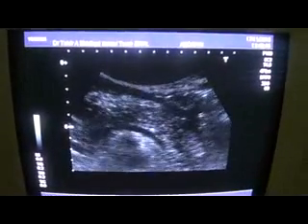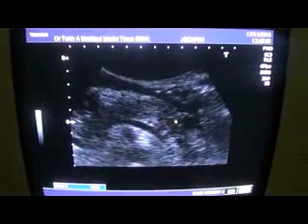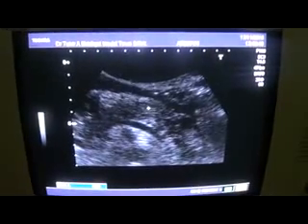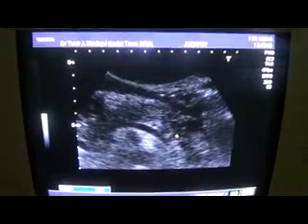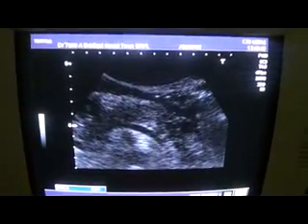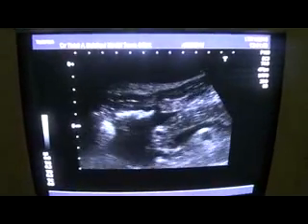So this is an obstructive form of pancreatitis. This is a cystic area, this is a cystic area, this is a cystic area. These cystic areas are seen more in the region of the tail of the pancreas. This is the tail of the pancreas. This is the splenic vein as a landmark for the identification of the pancreas.